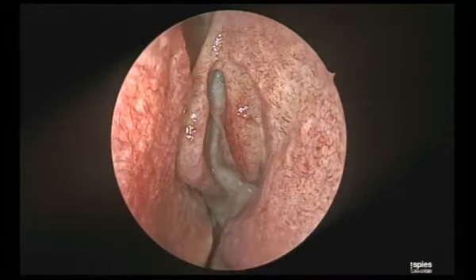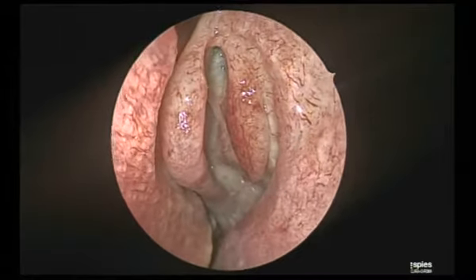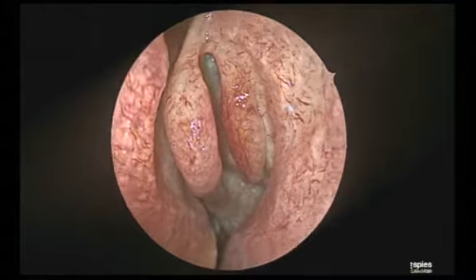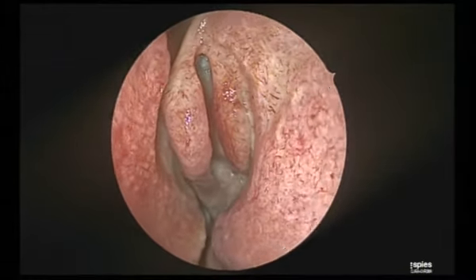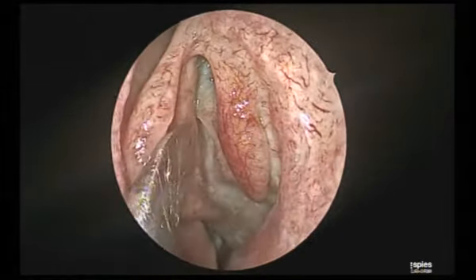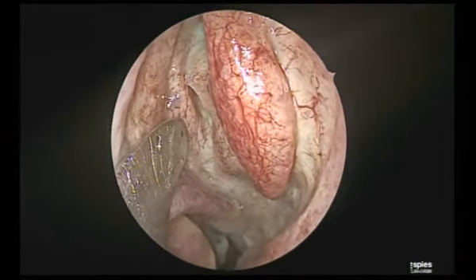So whatever you operate, in the post-op you can advise irrigation reaching everywhere in the sinus cavity. Everything said and done well, if your middle meatus is blocked by the middle turbinate laterally in the post-op, everything can go as a futile exercise. So you need to ensure your middle turbinate is stabilized along the septum. And the only thing I do, which works in over 90% of the situations, see what I am doing.